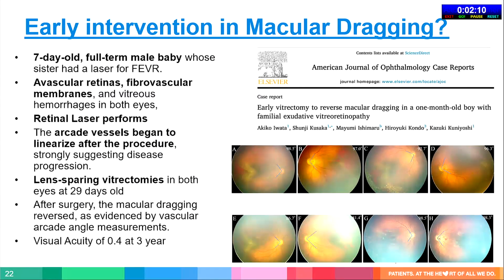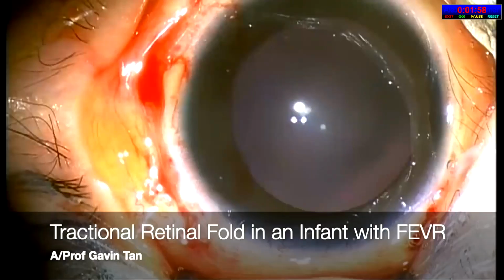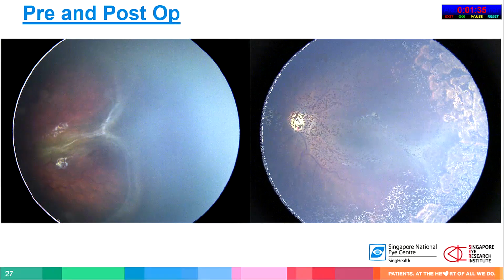I think there's some evidence that in progressing macular folds, early intervention can be useful. This case that was presented by Dr. Shinji's group, we had a similar case with progressing retinal traction in spite of laser that benefited from removal of the posterior hyaloid as well as the internal limiting membrane. And again, you just remove it to the ridge. You don't want to remove too much peripheral tissue that might result in an inadvertent break. And here, ILM was also removed. And the patient did well without progression of the fold, and maybe some unfolding of the fold subsequent to that.